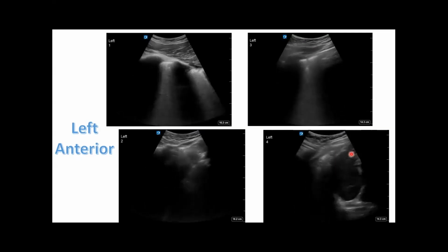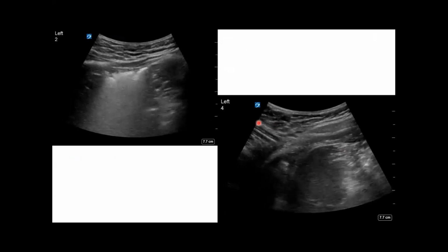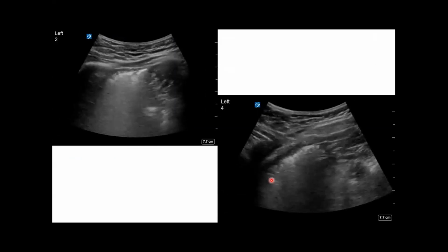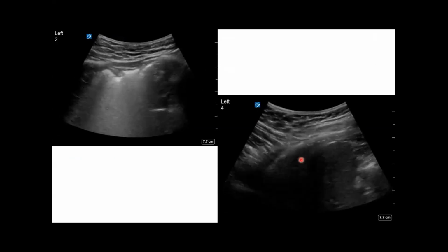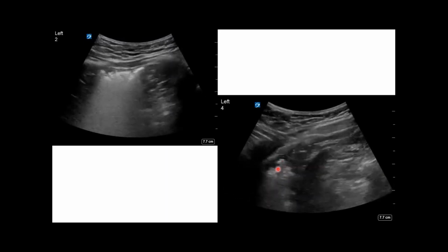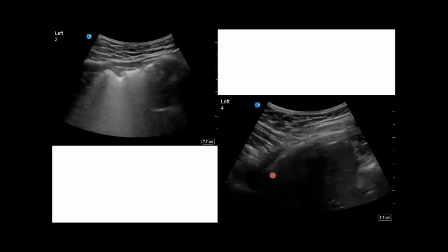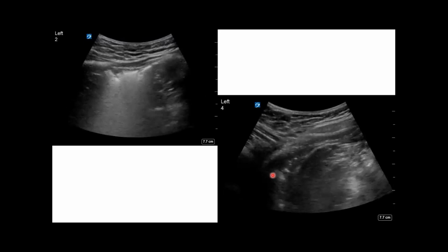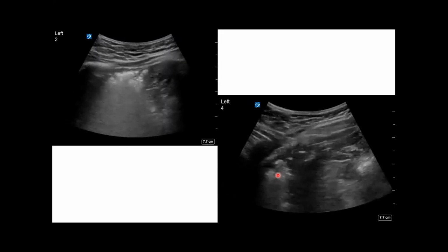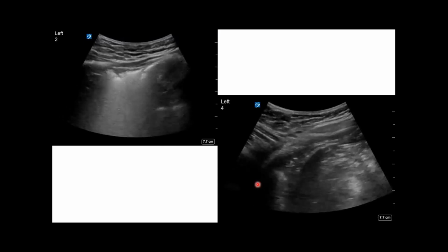Can people appreciate that? And again, crank your depth down and you can see these areas better. So you're seeing this irregular pleural line in L2 with subpleural consolidation. And then in L4, where we were just looking, you're seeing all this lung with air bronchograms in consolidated lung. Now, if you were scanning your patient in the unit and they've been on the vent for like 2 weeks, most of these patients are going to get atelectasis, and oftentimes you're going to see air bronchograms that are static, meaning when they have a breath from the vent, they don't move in and out through the bronchioles. When you have a consolidation from pneumonia, typically you'll see dynamic air bronchograms, where the air will actually go in and out and you'll watch it with respiration.